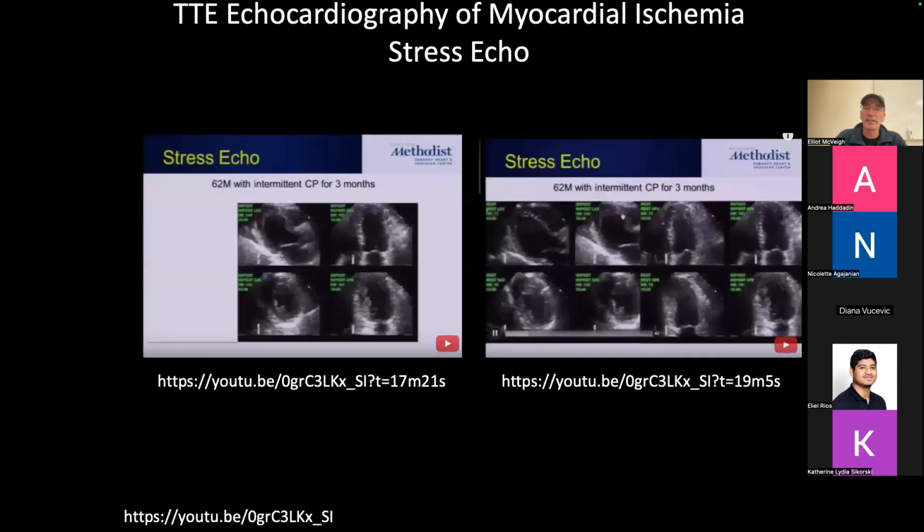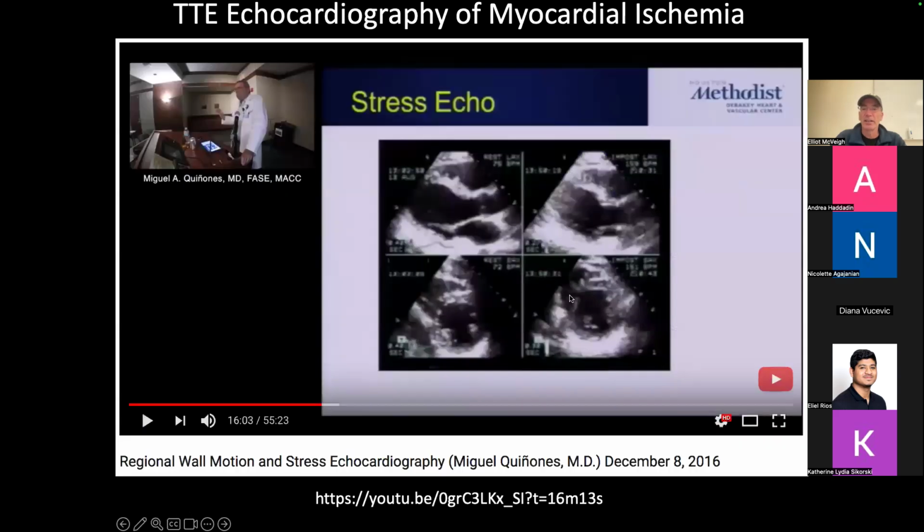Okay, so this is called stress echocardiography. It's really an interesting use of ultrasound. And so I've put all of the links to this guy's lecture. He's super experienced on this test. And it turns out that to uncover heart disease in some people, you need to stress them.